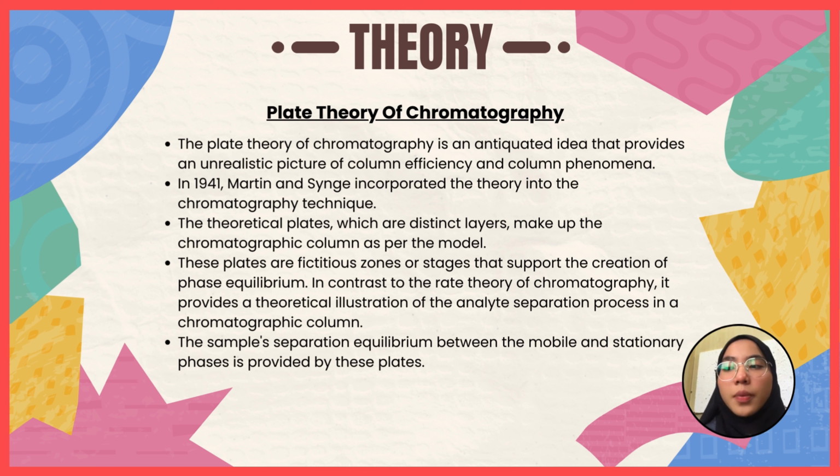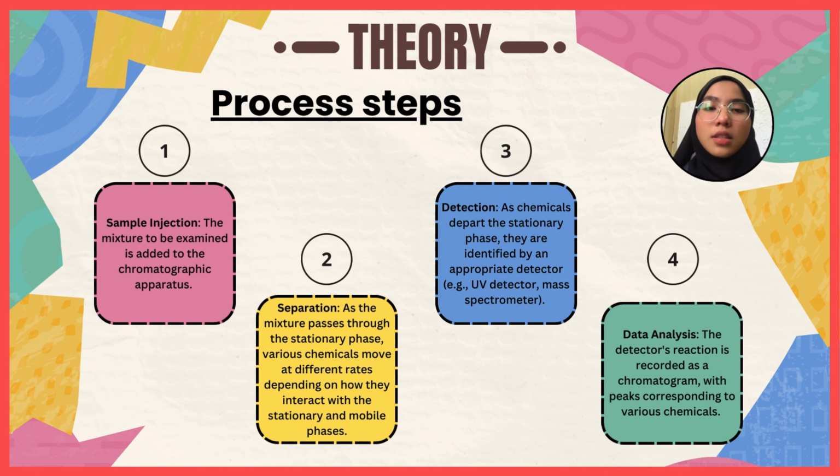The sample separation equilibrium between the mobile and stationary phases is provided by these plates. As you can see, this is the process step. First, we have sample injection. The mixture to be examined is added to the chromatographic apparatus.